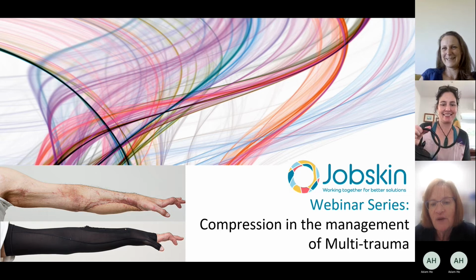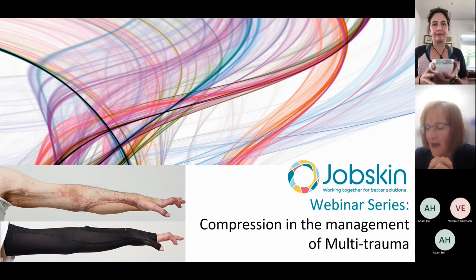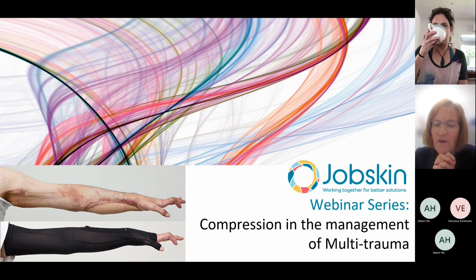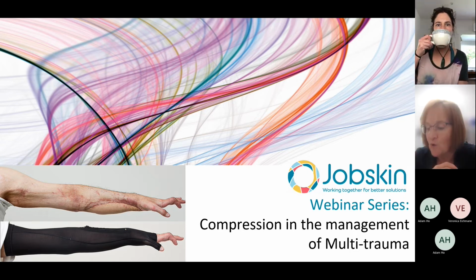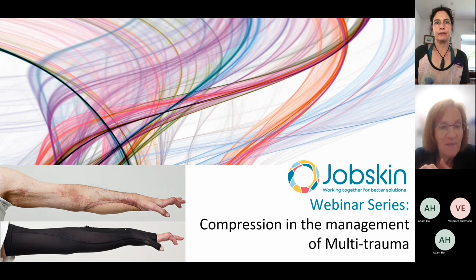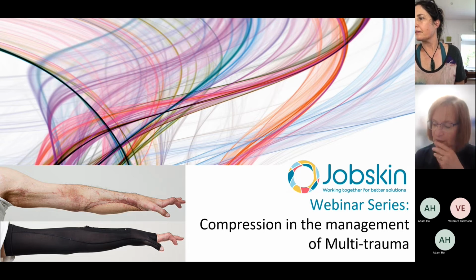Today we're going to be looking at compression in the management of multi-trauma, and it's a fairly loose definition of multi-trauma because multi-trauma comes in all sorts of forms. It's one of those areas that's very challenging for us as clinicians because there's so much variation from the norm. There are changes in anatomical structure and body proportion, but also amputations, defects, free flaps, stomas, catheters, external fixation, a whole lot of things to work around.